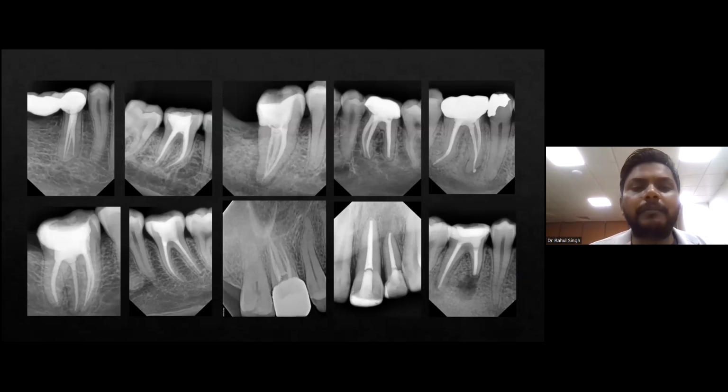To do a basic root canal, we should know what the basic steps are and how we are going to proceed. Obturation is nothing but a reflection of your cleaning and shaping, that is your chemico-mechanical preparation. And it is evaluated based on the length, taper, and also the density and the level of the GP obturation.